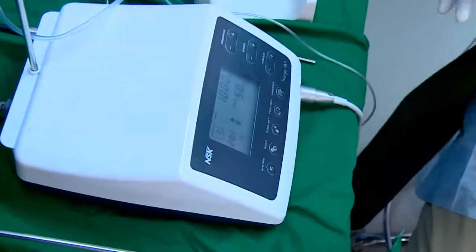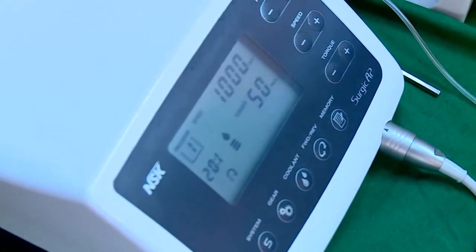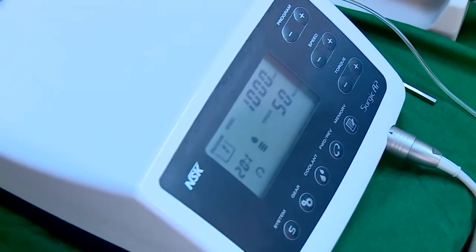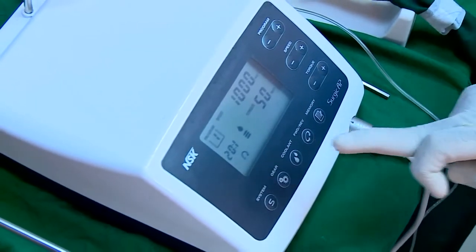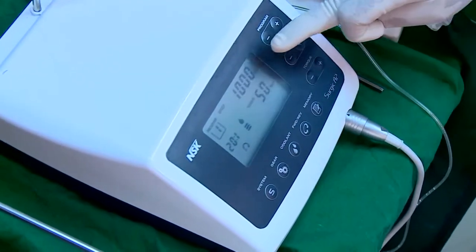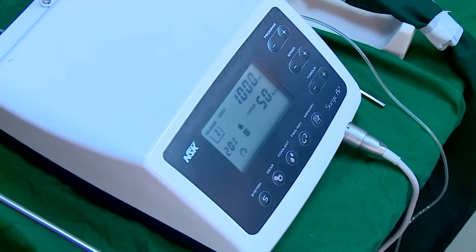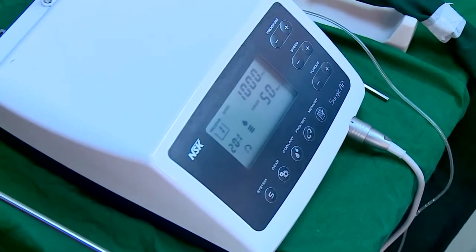This one. Now, this is a physio dispenser. When we talk about a physio dispenser, this handpiece itself is special in that it reduces the speed. It reduces the speed 20 times. It has gears, so we have a speed of only about 1000 RPM. The ideal speed for implant placement has to be anything between 800 and 1000.